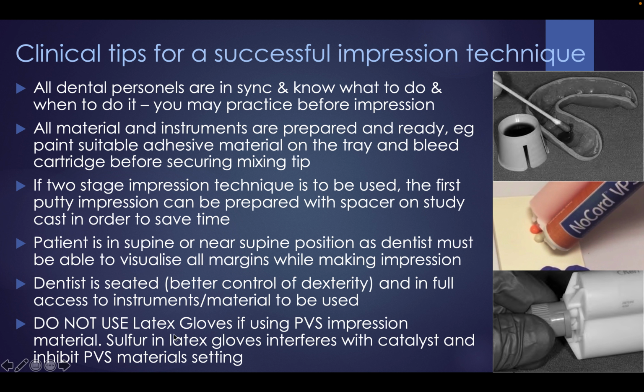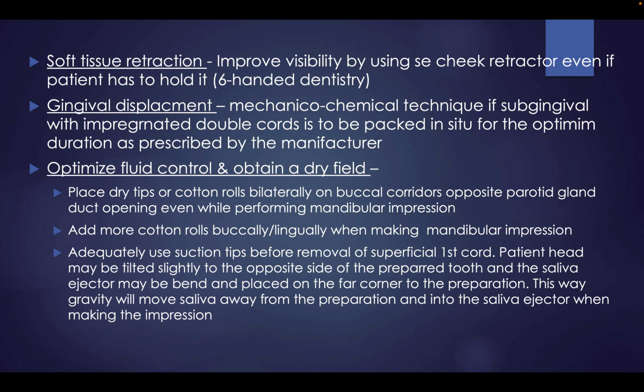Do not use latex material, because if you're using PVS, the setting of PVS can be inhibited by the sulfur in latex. So avoid using latex, or ask the assistant or partner to mix the putty with either bare hands, disinfected, or with non-latex gloves.